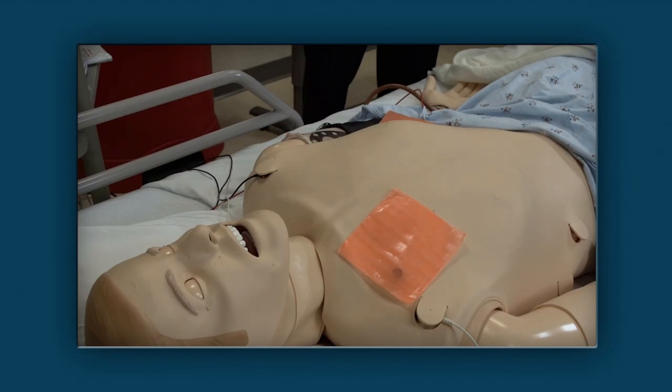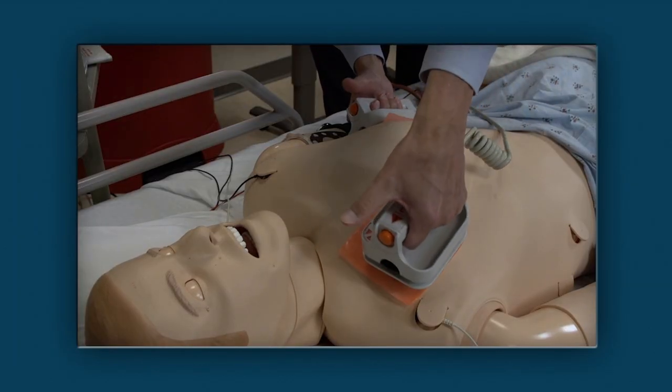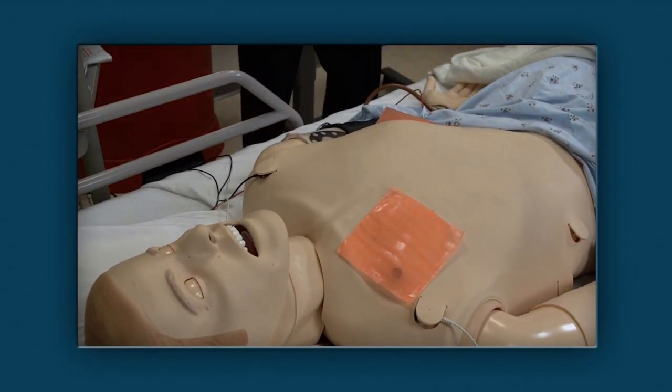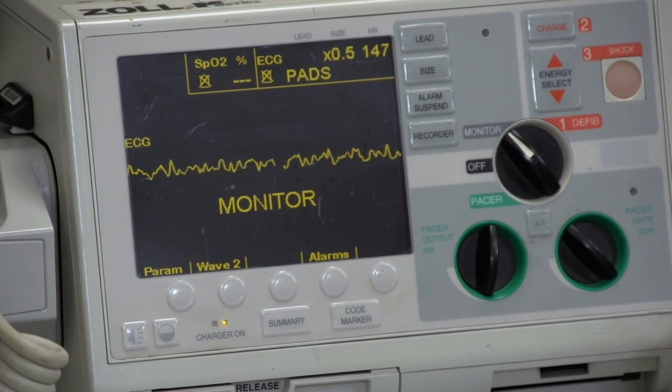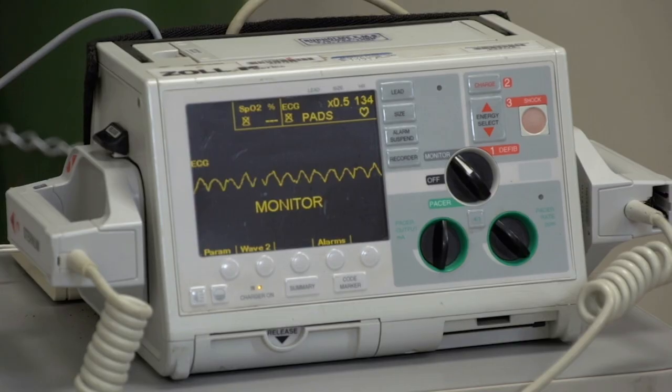Rapid defibrillation can be life-saving. Defibrillation is used for ventricular fibrillation and pulseless ventricular tachycardia.